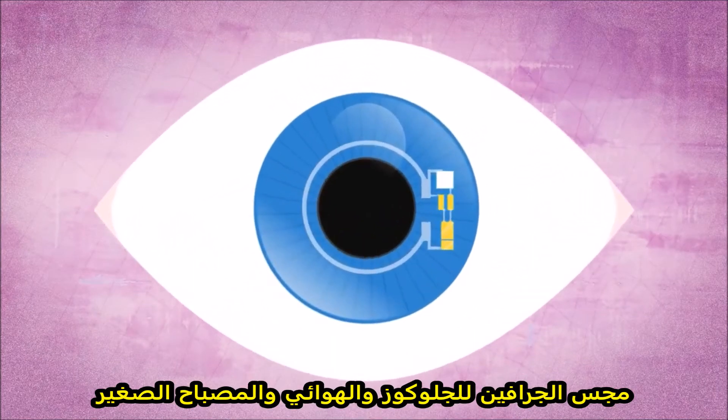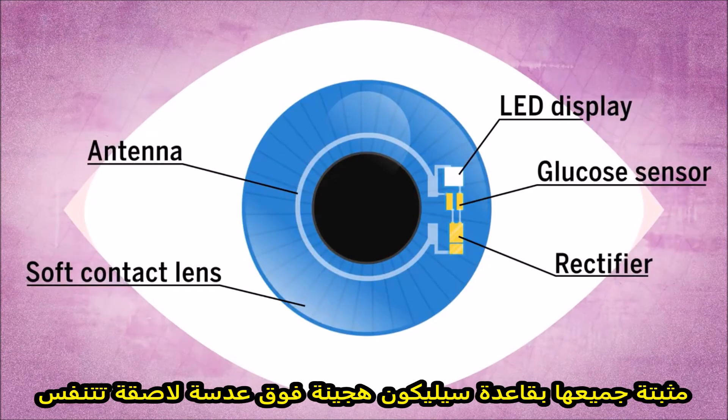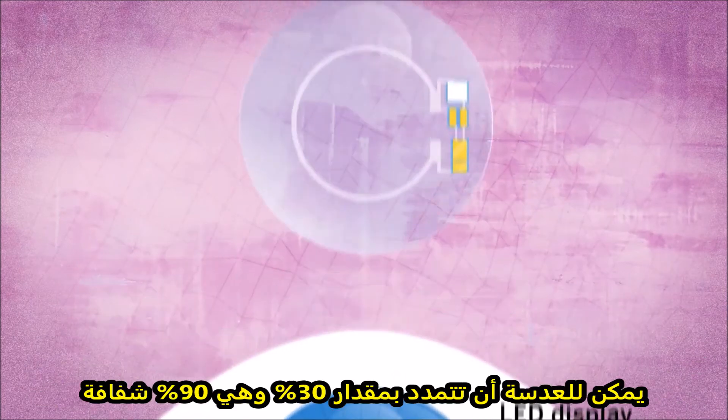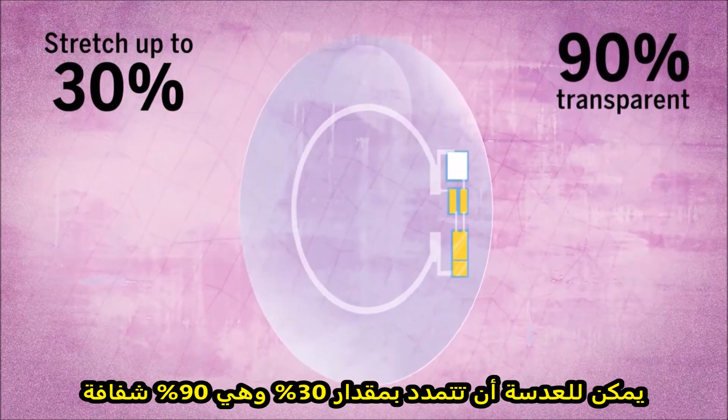The graphene glucose sensor, the antenna, and the LED are all embedded in a silicon hybrid substrate that sits on top of a breathable contact lens. The lens can stretch up to 30% and is around 90% transparent.